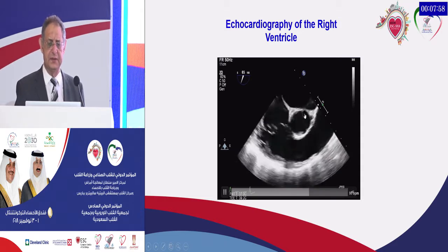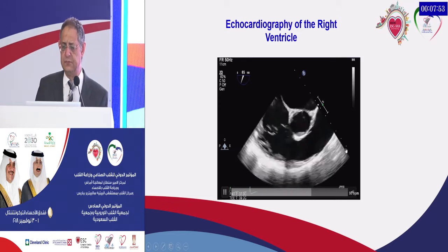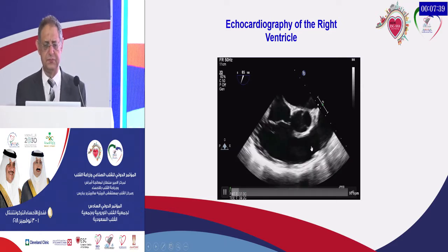Another important view which helps us to guide the RV function is the RV inflow-outflow tract view. You can observe the RV contractility nicely in this view also.